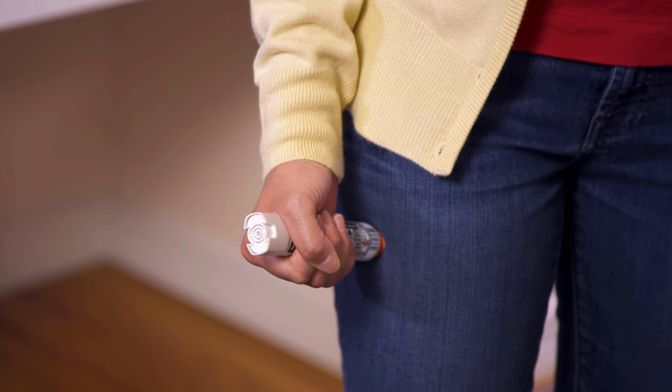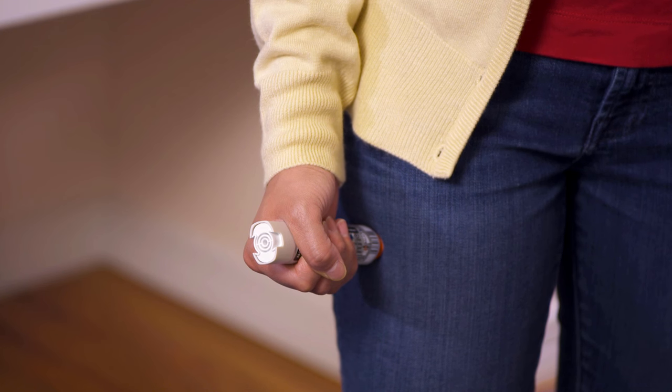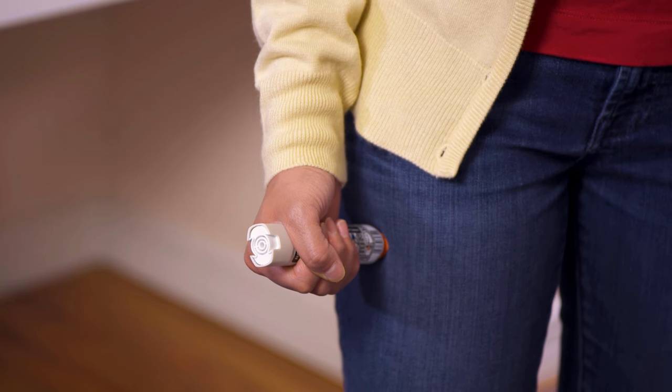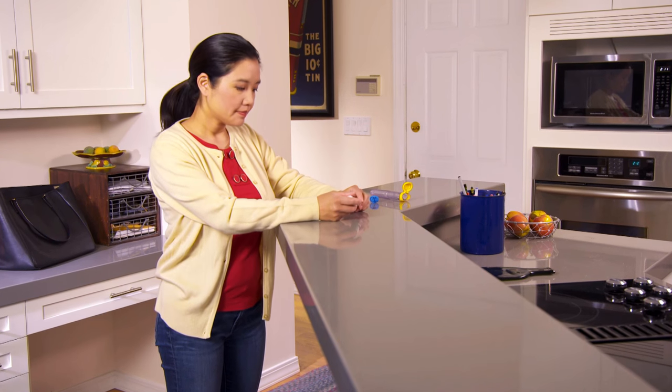You'll hear a click as the medicine is injected. Hold the injector firmly against your thigh and slowly count to 10. This makes sure all the medicine has been injected. The injector works through clothes, so you can get the medicine into your body quickly. Now pull the injector away. You should start feeling relief right away.